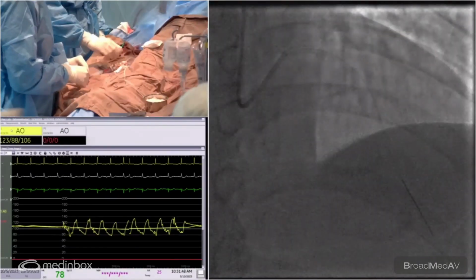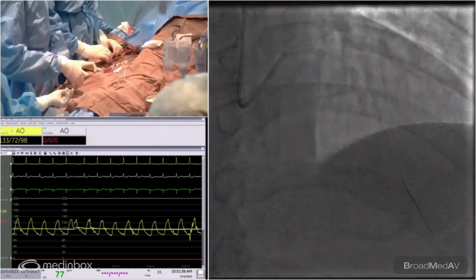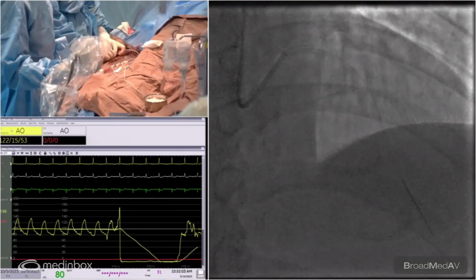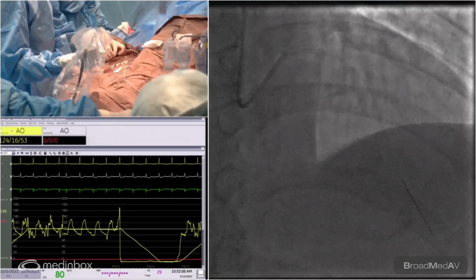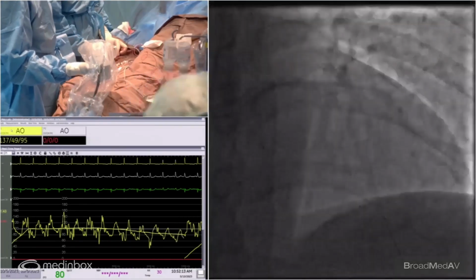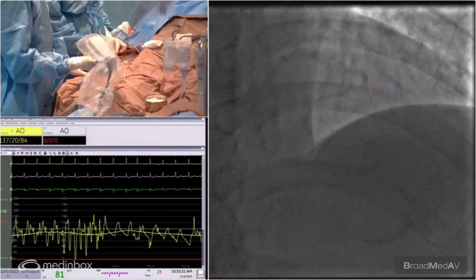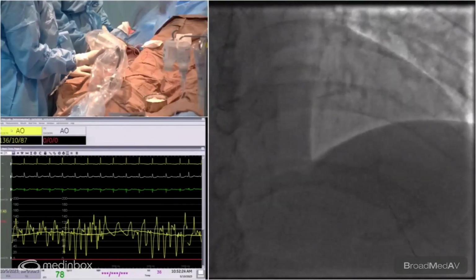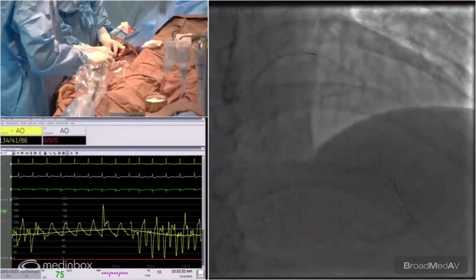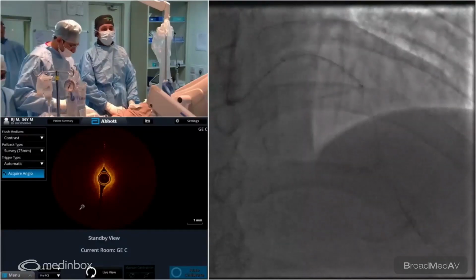So let's get the OCT catheter now, and this is an Abbott St. Jude OCT catheter, which we are now getting down the lesion. As you know, OCT functions on light, and the reason we use it over intravascular ultrasound for imaging in-stent restenosis is that it gives you certain characteristics, especially what is the form of in-stent restenosis, whether it's an underdeployed stent. Atherosclerosis is very well imaged with OCT. So you can see that we can go a bit further. Go in. Yeah, go right through the stent. So we go right across the stent with the OCT catheter.